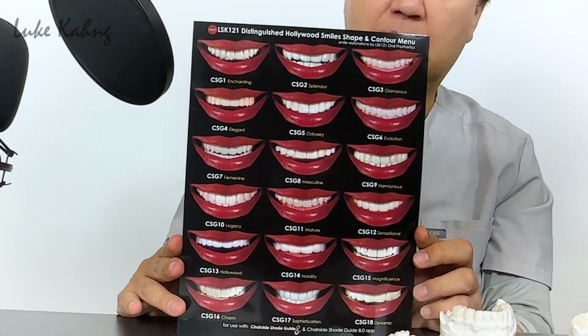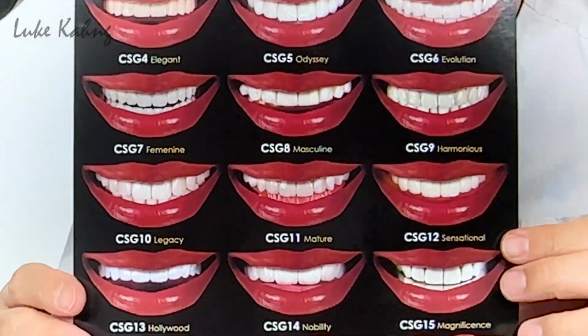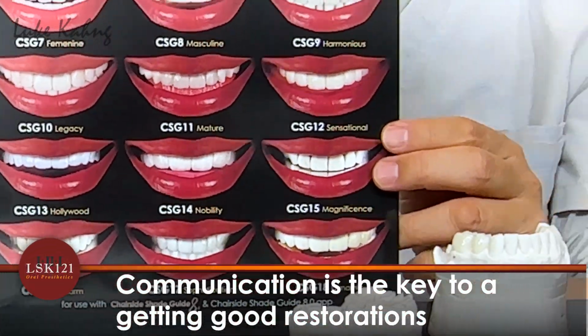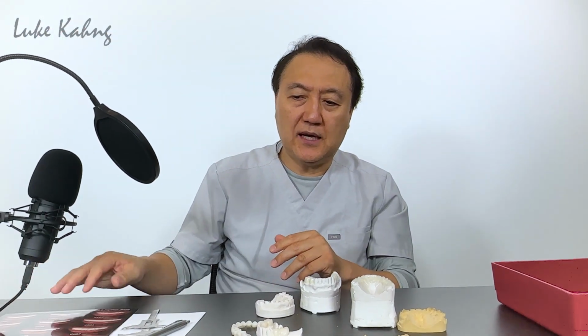So the doctor and patient can utilize it as my temporization, and we're trying to give them guidance with this so they can utilize it. The final restorations, what shape do they like, right? The communication is key to make the final restoration a success.